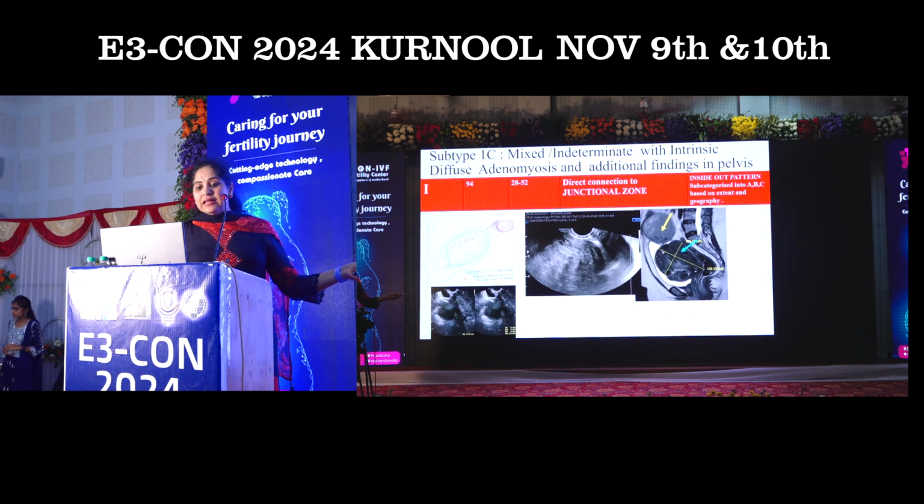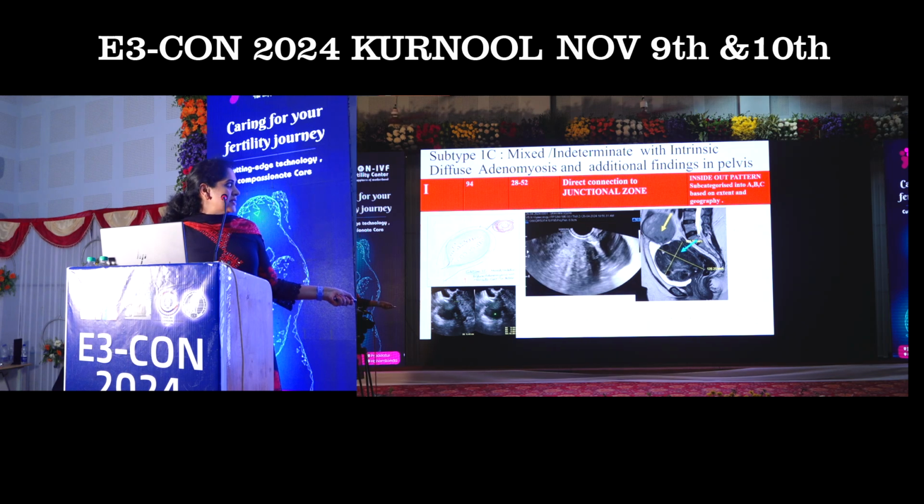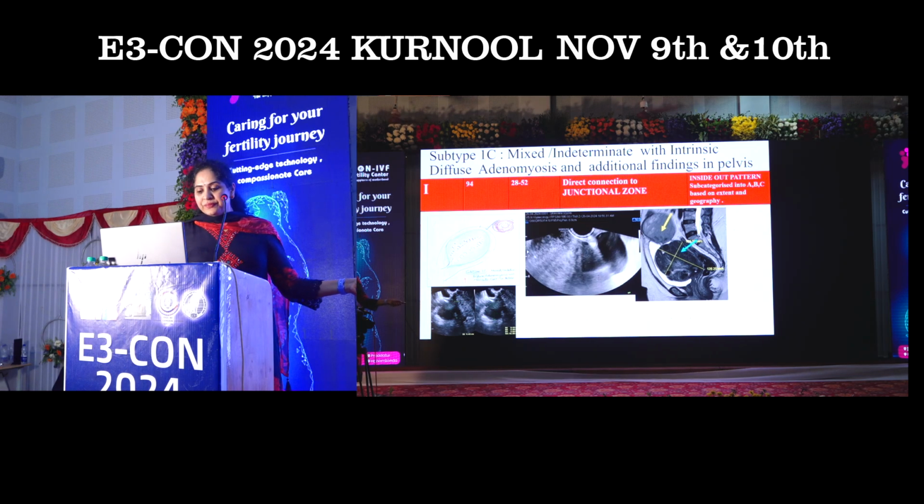Contrary to this, the subtype 1C is mixed indeterminate with intrinsic diffuse adenomyosis and concomitant pelvic endometriosis. Like this is an intrinsic diffuse adenomyosis with presence of concomitant chocolate cyst, pelvic endometriosis.